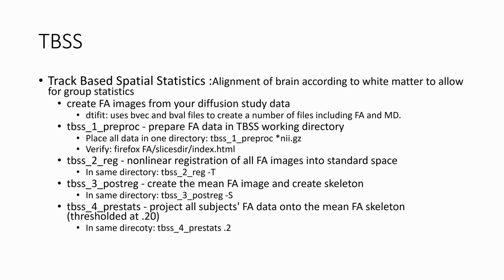So this is where I want to go back to that question of crossing fibers. If you have crossing fibers, you're going to have a very low FA value. It's not going to have one eigenvalue that's much larger than the other ones, and it's not going to show such a path.